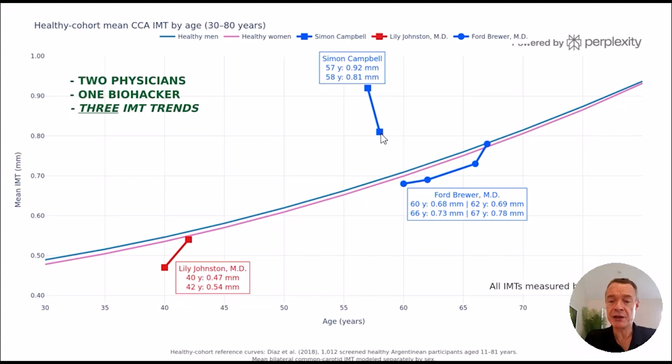Now, that's 1 year regression, and that's just 1 year. I don't think I've ever heard of anyone doing it in consecutive years, because our artery walls get thicker as we age. Well, yours truly is going for a second year. You know, I just added a PCSK9. We'll see what it does. I've got some other fun things I'm cooking on, biohackery stuff.